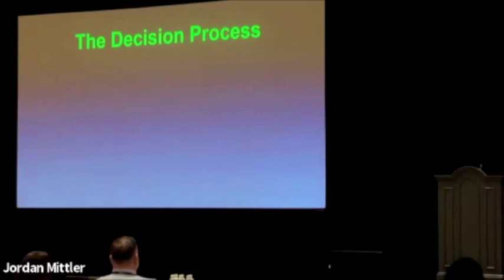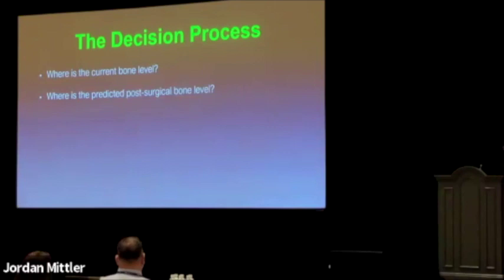So the decision process really goes, where's the current bone level? Where's the predicted post-surgical bone level? This is trying to make sure we don't show that prosthesis interface.